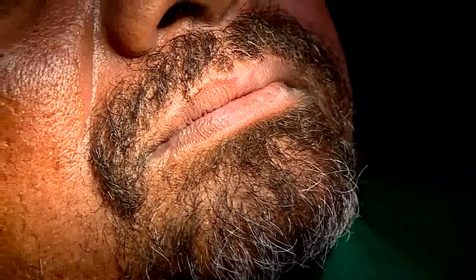So let's start with the procedure now. The procedure will include, first, infiltration of the area with the local anesthetic. When we speak about infiltration in a biopsy patient, we cannot infiltrate in and around the area of the lesion. So we have to take a margin of at least 1 to 1.5 centimeter away from the area, and following that we need to infiltrate local anesthetic. Please do not inject LA into the area of biopsy, because that is going to distort the histopathological findings the oral pathologist is going to look for.